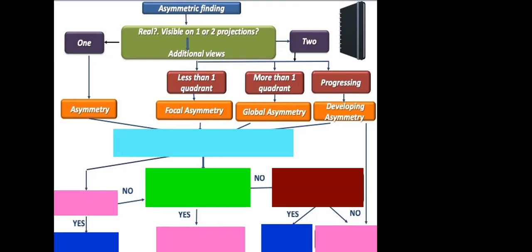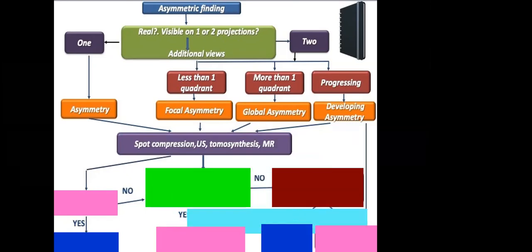So I have to go further by additional. Okay, I can do additional mammographic views. What else? Apart from additional mammographic views, ultrasound. Ultrasound, what else? Additional mammographic views, ultrasound, tomosynthesis or MRI. Okay, so spot compressions or other mammographic views, ultrasound, tomosynthesis or MRI.